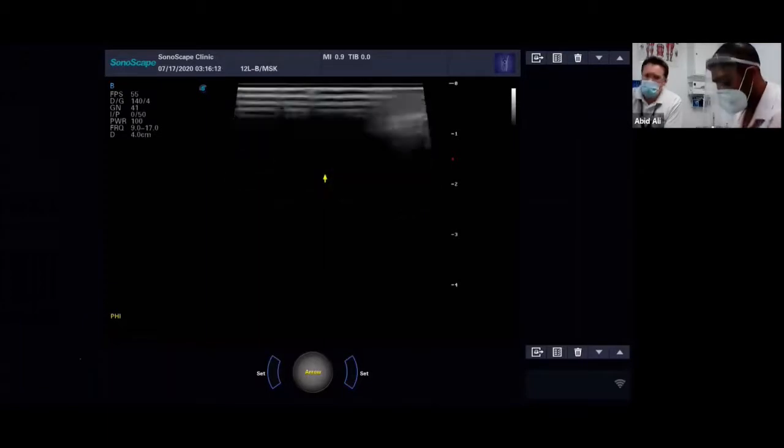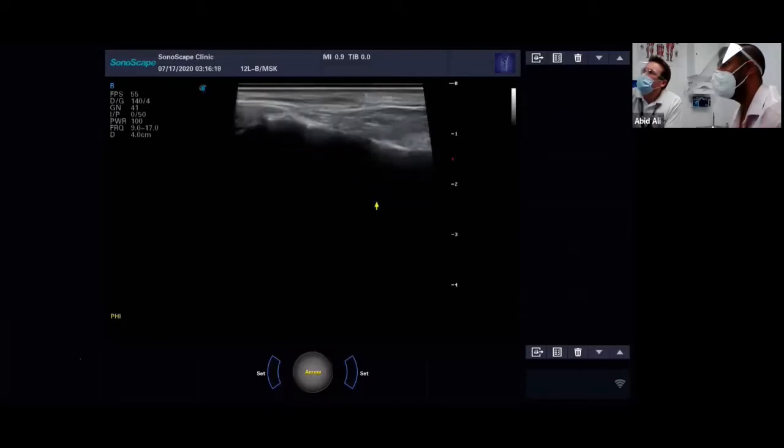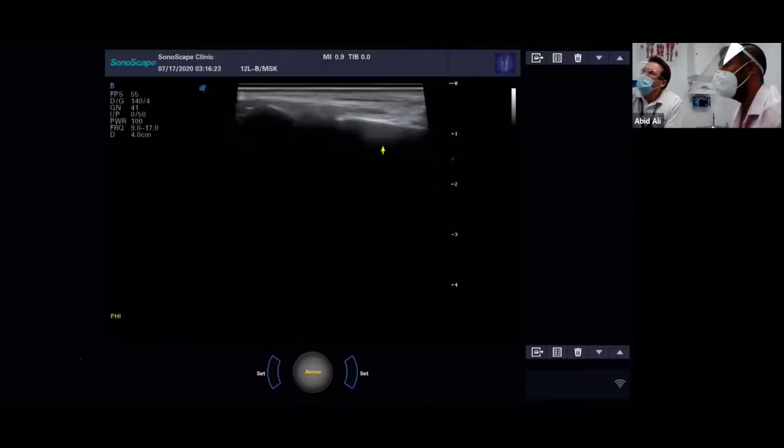Okay, so let's go down a bit further and let's show you the talonavicular joint. So can you see here, we're just on the body, the top of the talus. Keep that signal nice and bright. And then here we've just approached the talonavicular joint, which I'll rotate a little bit so you can see some movement in it. So we're looking down at the superficial part of the joint. We can't see any deeper than that. We can just see the periphery, but you can make out degenerative changes here.